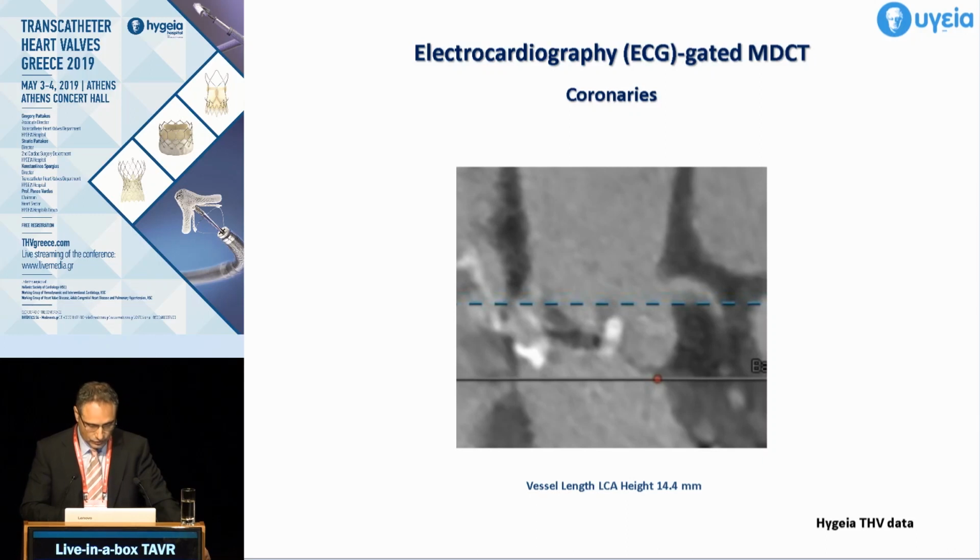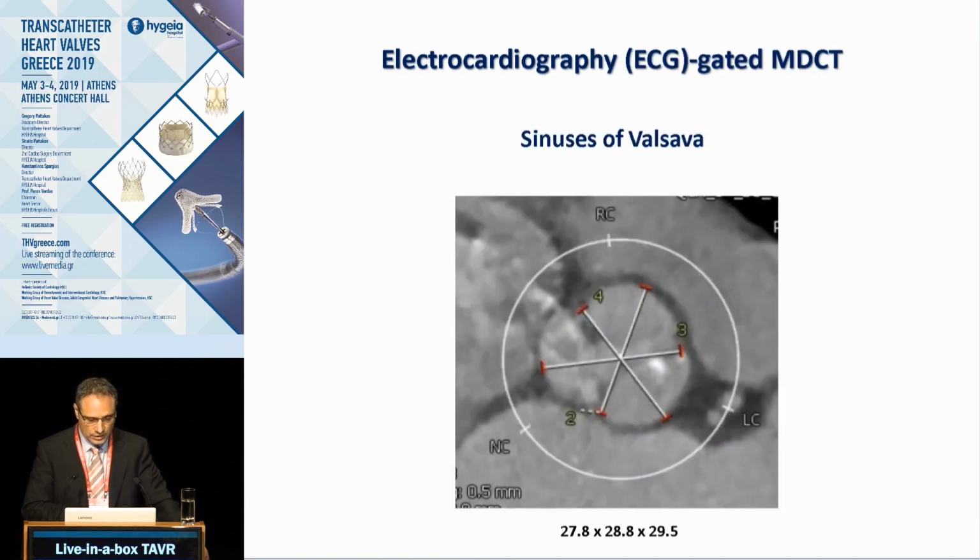At the same time, we estimated the height of the coronaries, although the right side was protected, and the CT analysis revealed moderate calcification at the level of the aortic arch and a bovine aortic arch with a common origin of the brachiocephalic trunk and the left common carotid arteries.